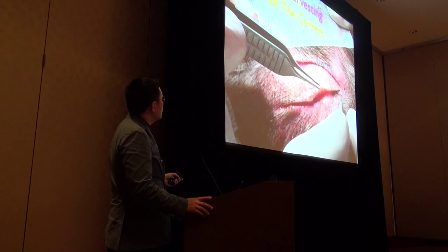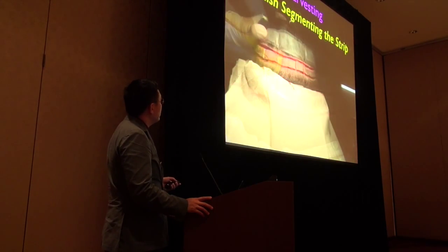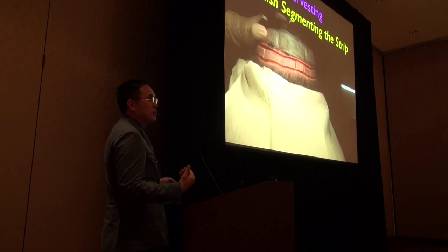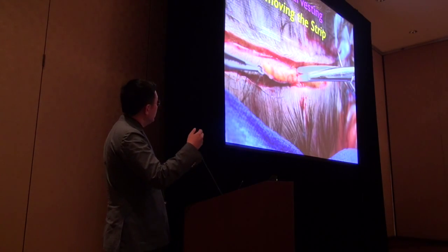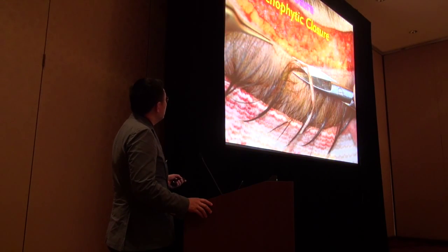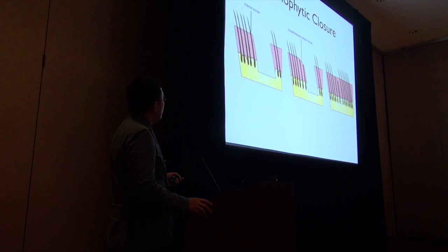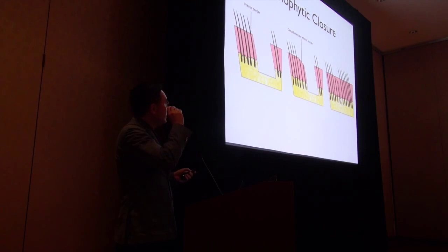I come back, finish the corners looking for transection. I remove a 2 cm segment so my staff can begin the graft count process. By the time I've closed the wound, they give me a projected graft count and I can start designing my recipient sites. Finishing the strip, I segment it into smaller pieces, take it out with Metzenbaum scissors, and do a trichophytic closure if there's not too much tension. The bottom ledge is de-epithelialized so hairs grow through. But it's not the trichophytic closure that leads to good wounds — it is the good harvest.